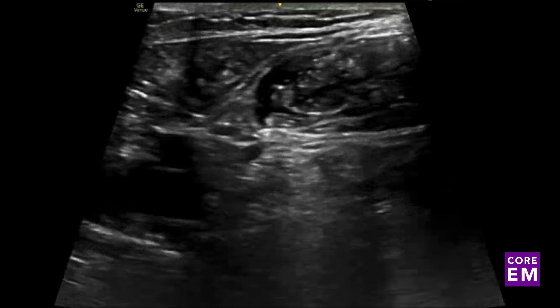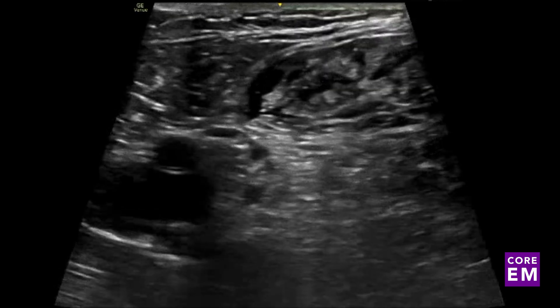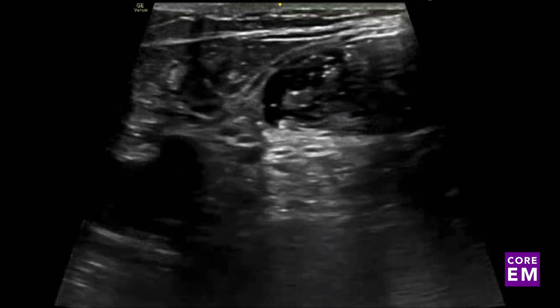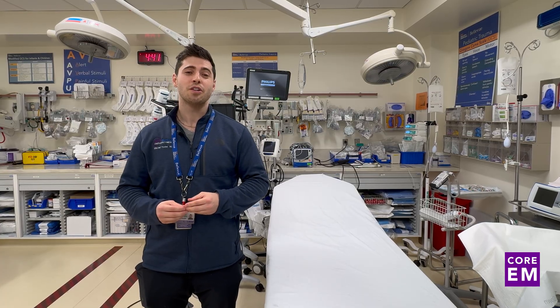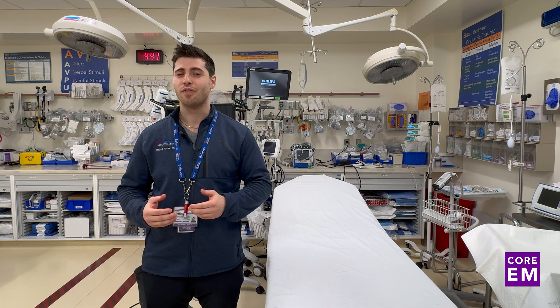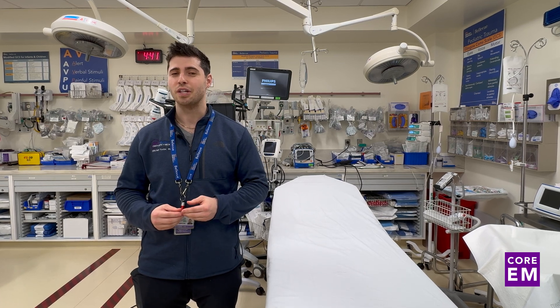The patient should be monitored on a cardiac monitor during this procedure to ensure there are no significant cardiac side effects from the large dose of lidocaine or bupivacaine. A pro tip: we recommend using color ultrasound over your area of interest to identify any additional vasculature that may be in the area and avoid intravascular injection.